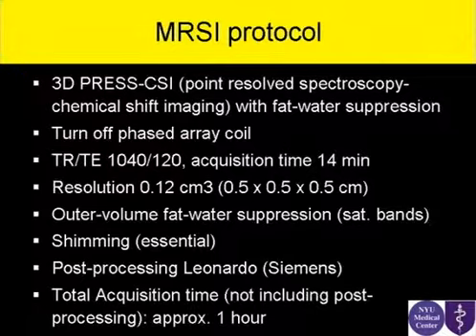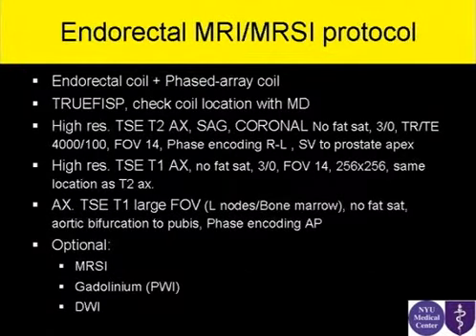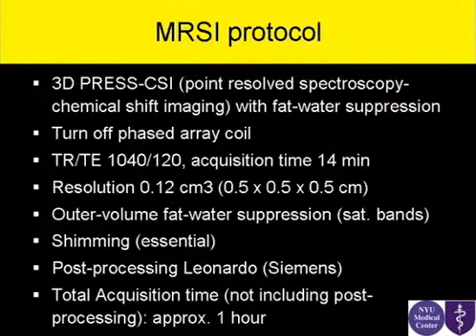And you can also use diffusion weighted imaging, but these 2 sequences are not really validated yet. There are some papers on gadolinium images for the last 2 years, but it's still work in progress, I would say. Diffusion imaging, same thing. Probably 1 or 2 papers in the literature, a lot of abstracts in the MRI meetings, but nothing really definite.